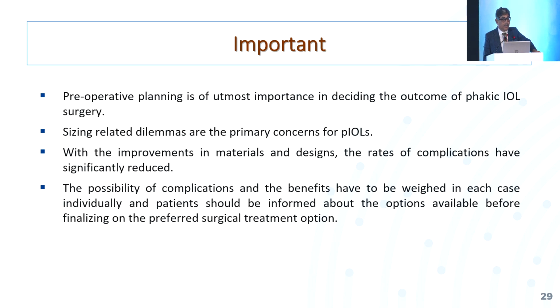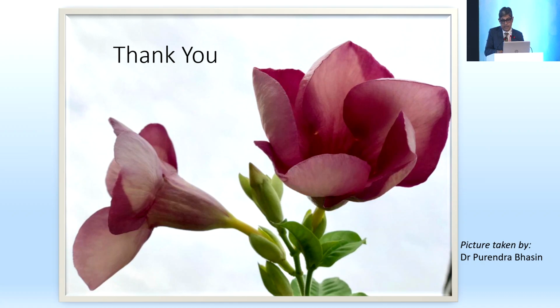If our preoperative workup is very good, preoperative planning is very, very important in deciding the outcome of phakic IOL. I think if you give more time to the preoperative planning, then your postoperative results are predictable, and you don't have to give much time pre or postoperatively. Sizing related dilemmas are the primary concern of phakic IOL, and with the improvements in material and design, the rate of complications has significantly reduced. The possibility of complications and the benefits have to be weighed in each case individually, and patients should be informed about the options available before finalizing. I thank you for your patient hearing.